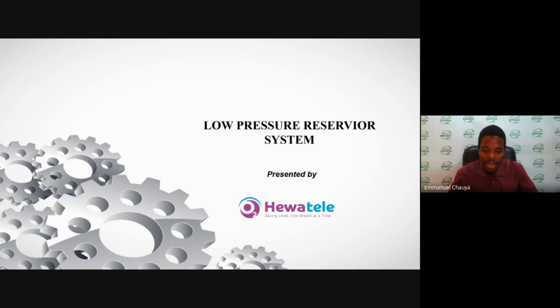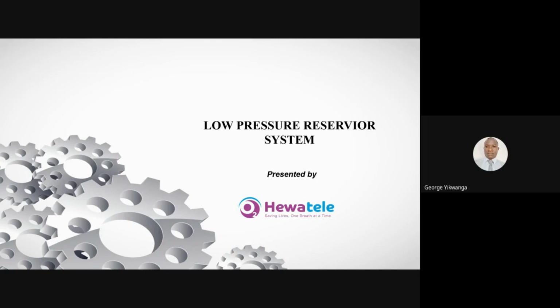Okay, so we have a hand from Georgie Kwanga. May you please go ahead and speak? Okay. The requirement to use this low pressure reservoir is in terms of having a concentrator of 10 liters per minute. Is it possible to have two concentrators that are 5 liters per minute each, and you combine them so that you use it with the one low pressure reservoir?